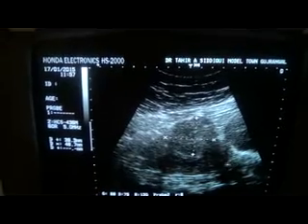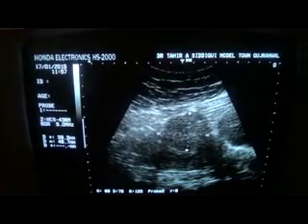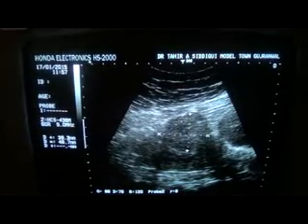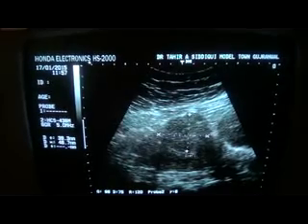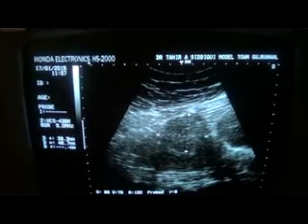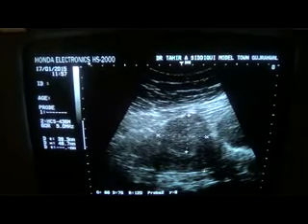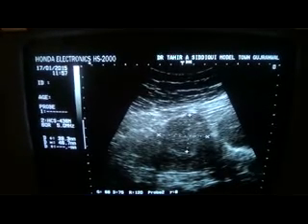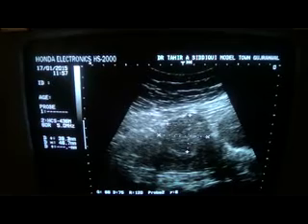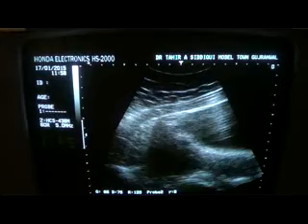You can see a small amount of fluid over here, and then as we move upwards, you see a hypoechoic area, well demarcated, and this is the endometrial canal which it is encroaching upon. This is the fundal region, this is the posterior myometrium in this longitudinal section. So up to this point of the study, we have seen that there is a fibroid approximately measuring 4.6 by 3.9 centimeters with a bulge, and it is a subserosal fibroid.